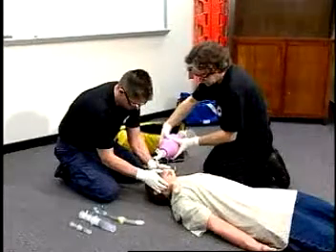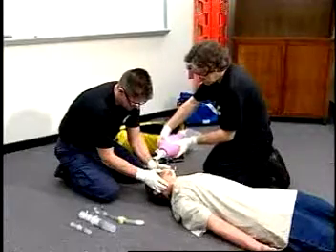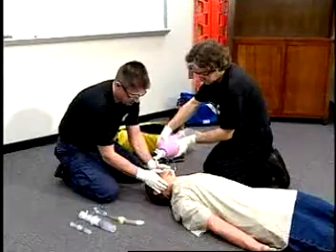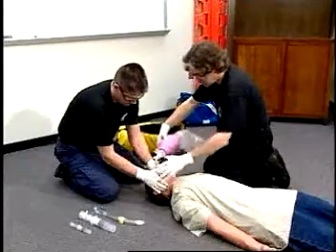Provide supportive ventilations as needed. Pre-oxygenate the patient using a basic airway maneuver and maintaining neutral in-line stabilization. Inspect and prepare the equipment as the patient's ventilations are being assisted.